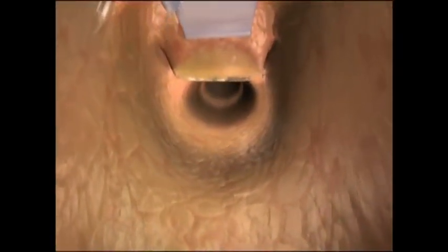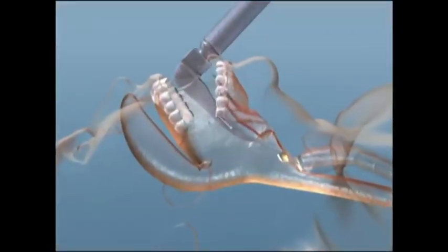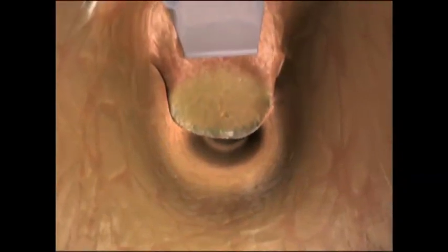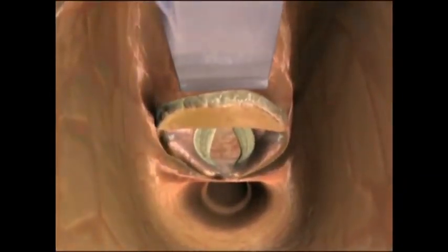Be careful not to force the blade against the teeth as they may break. Move the blade slightly towards the midline and advance the curved blade until the distal end is at the base of the tongue in the vallecula. Lift the laryngoscope handle slightly upward and towards the feet to displace the jaw, enabling visualization of the vocal cords.